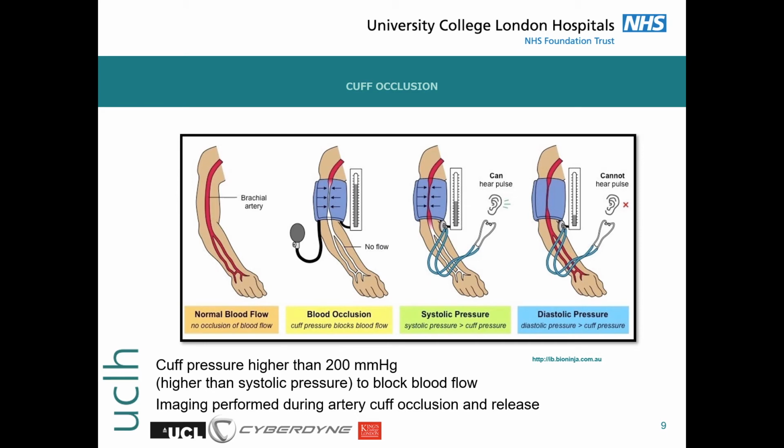In our final experiment, we used intermittent occlusion of a blood pressure cuff to model restriction of flow in blood vessels, like might be seen in conditions such as atherosclerosis or acute thrombosis. We hypothesised that photoacoustic imaging could respond rapidly to cessation of blood flow and similarly quickly to recovery.